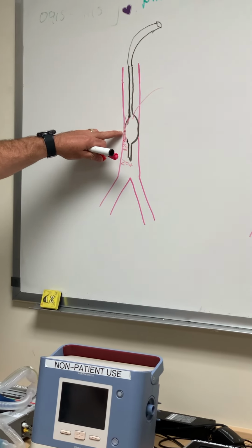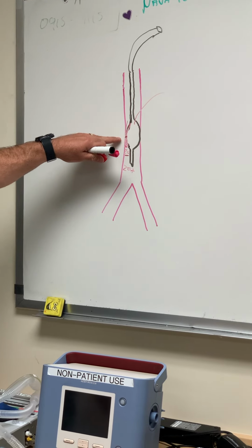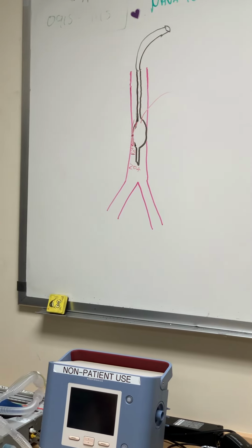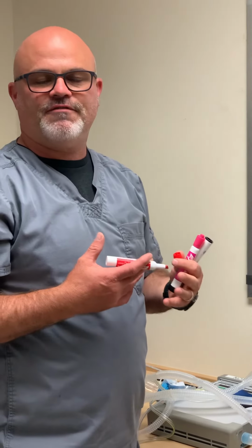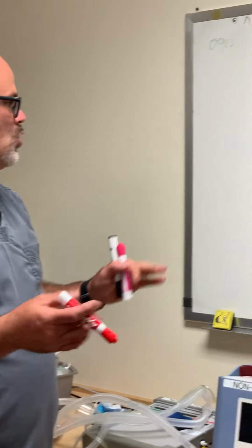Once we get that pressure on the tracheal wall from the cuff itself at 20 or higher than 20, now this 20 is trapped below the cuff and can't exit through that opening because it's sealing it off at that pressure. And that's where we measure how much pressure it is taking in the cuff to keep that leak from occurring. Okay, that's our normal practice.